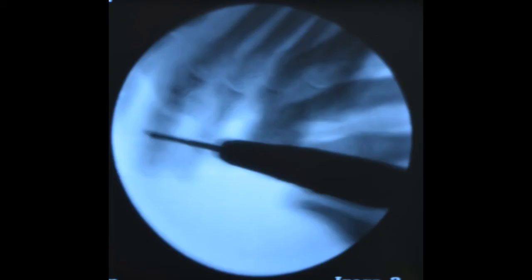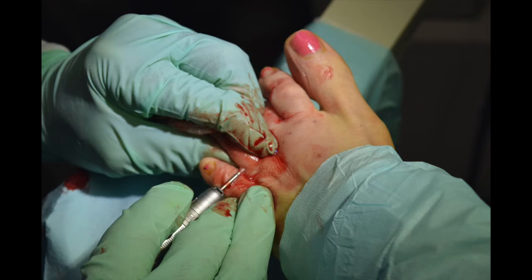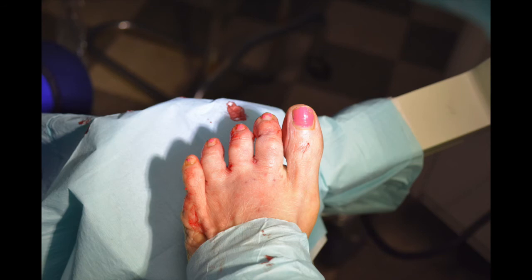This is showing the middle phalanx as we cut that. We went ahead and did this on digits two through four, and on the fifth we just did a proximal phalanx osteotomy. So we did all three center toes with two osteotomies each, and the small toe with a single osteotomy.